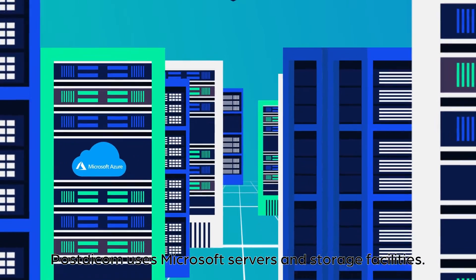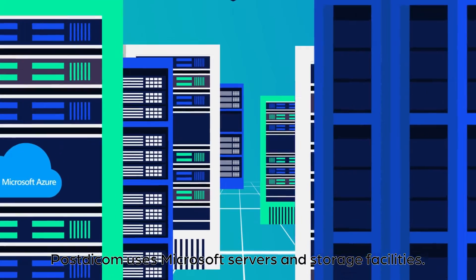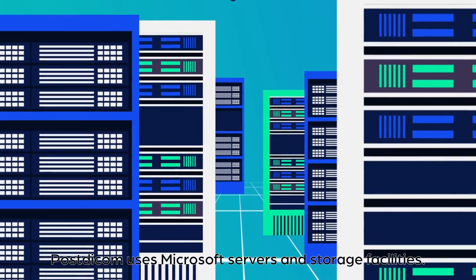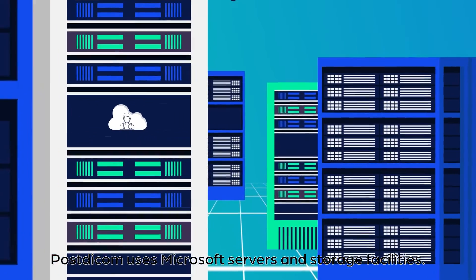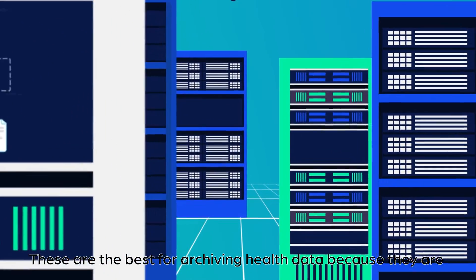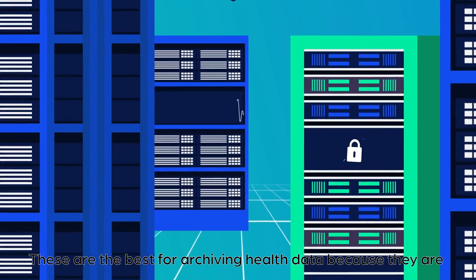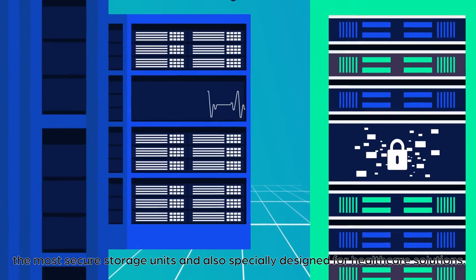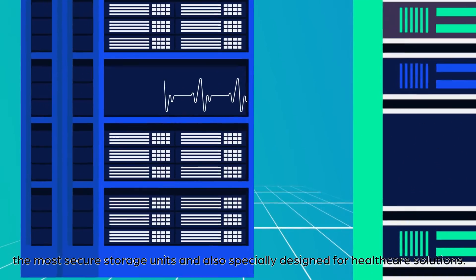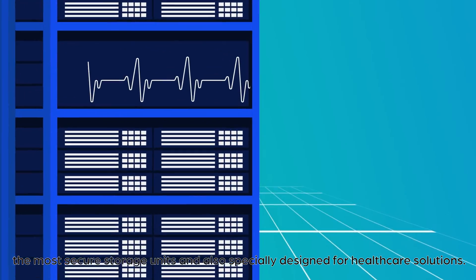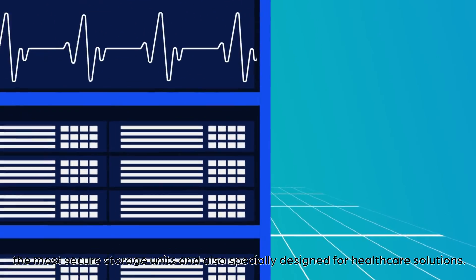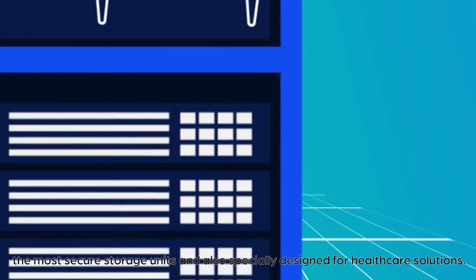Post DICOM uses Microsoft servers and storage facilities. These are the best for archiving health data because they are the most secure storage units and also specifically designed for healthcare solutions.